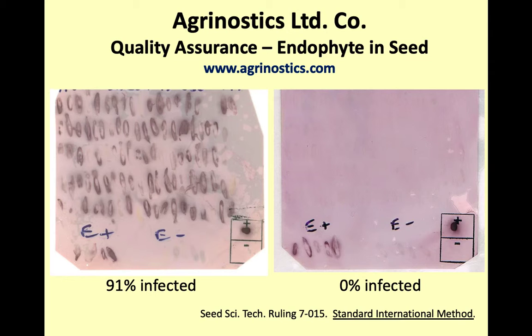You probably don't understand what that is, but I can give you a practical application that many of you have had in your life, a home pregnancy test. That is antibody chemistry. So we use the same technology, a little bit different format than you would have in a home pregnancy test, but same technology. And I've got a little demonstration up here of how we go about doing this.